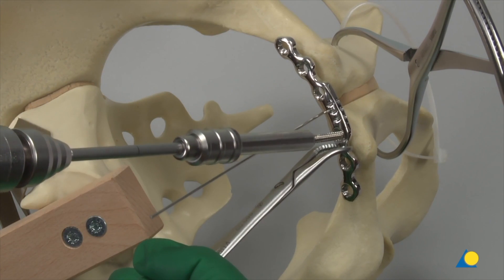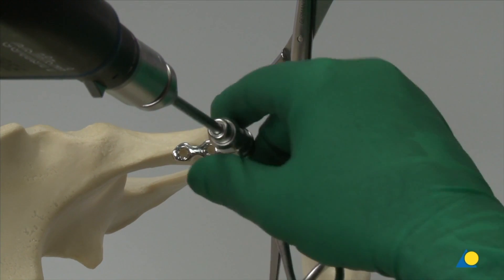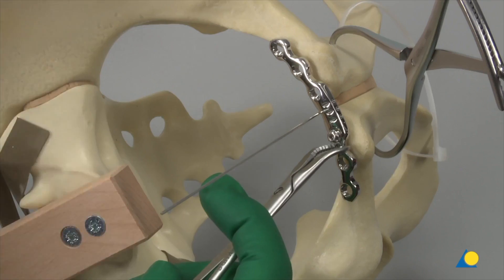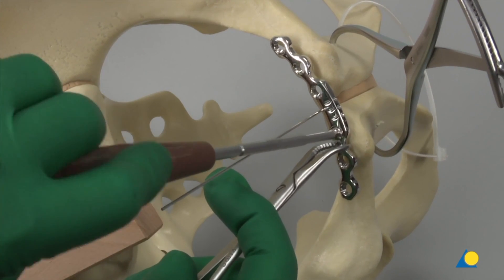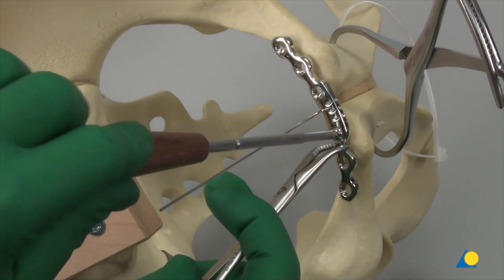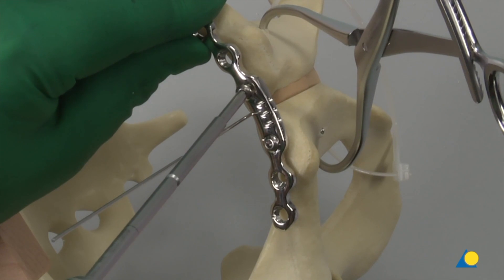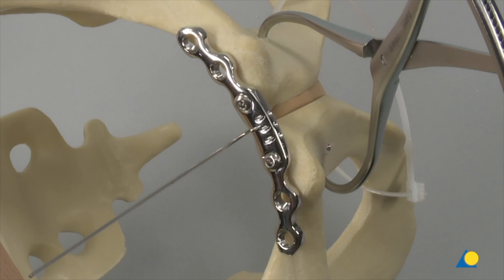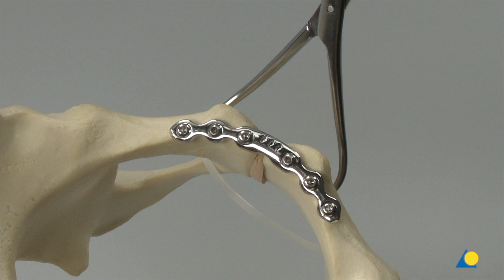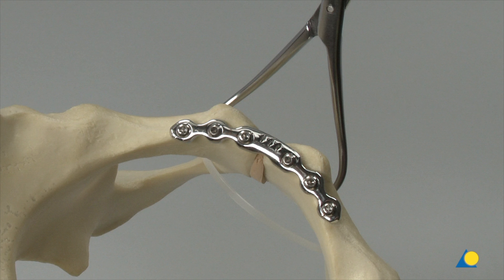Insert the screw with the machine and tighten it by hand. Control the alignment of the plate with respect to both superior pubic branches before fully tightening the first screw and insertion of the second screw. Insert the second screw close to the pubic symphysis on the other side in a slightly eccentric position to compress the pubic symphysis. Complete the internal fixation of the pubic symphysis by insertion of the remaining four screws into the pubic branches.